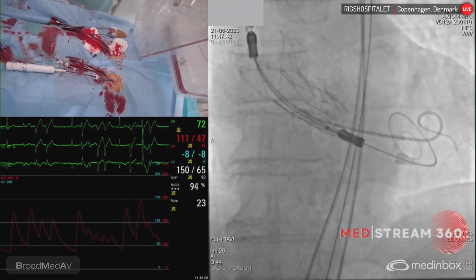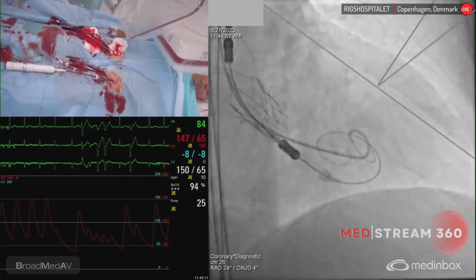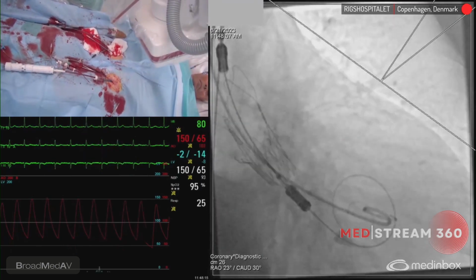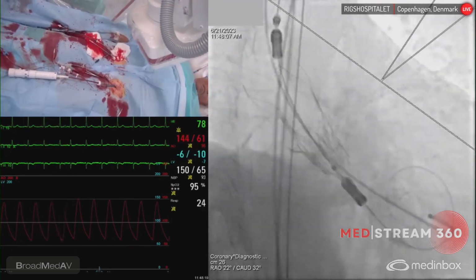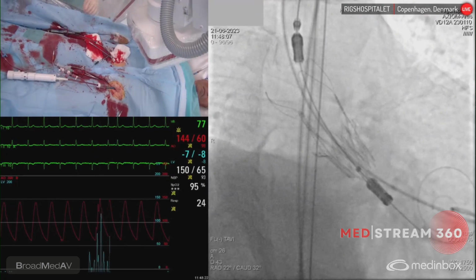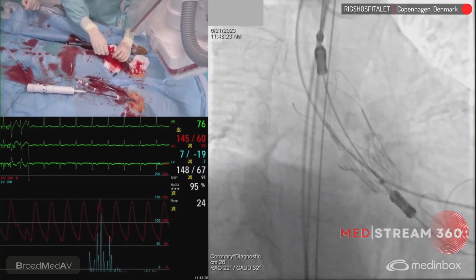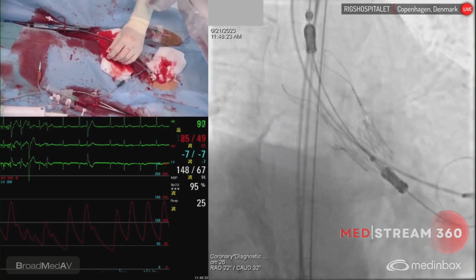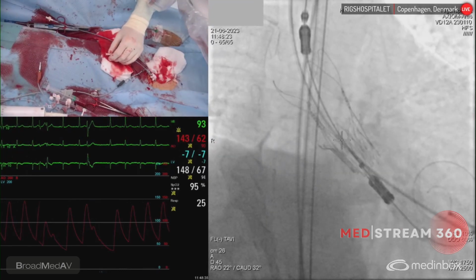We have to overlap both arches. Oh, it's very constrained, huh? So now we have overlap both. Yeah. And now we have to make sure that we're not on the outside of the frame, so I have to be able to push this. I think it is. We have to be 100% sure. That's the point. Let's go with 7.5. Yes, sure. Yeah. Okay.